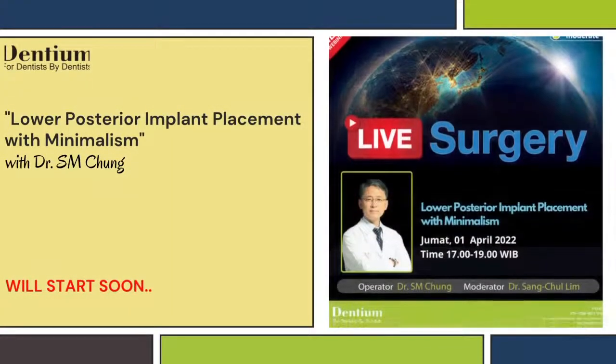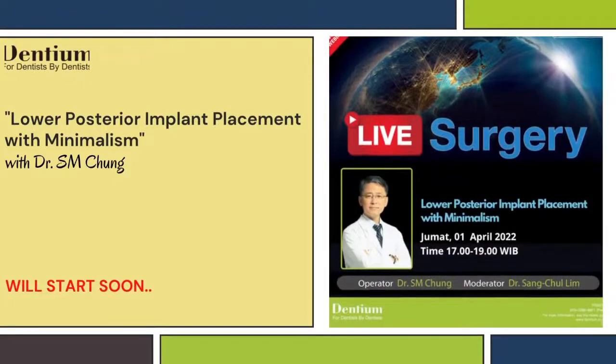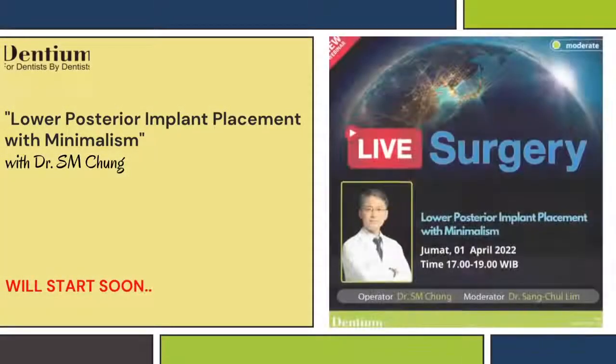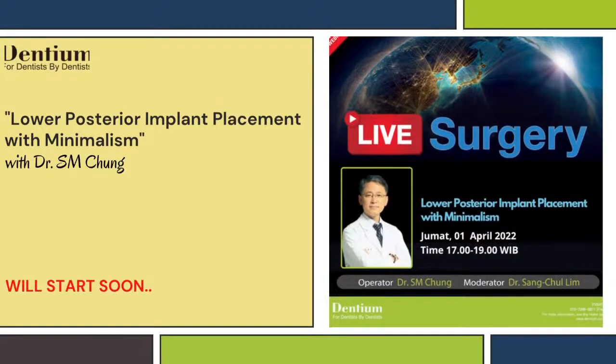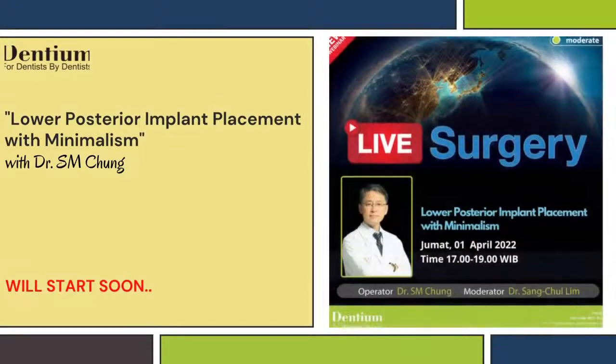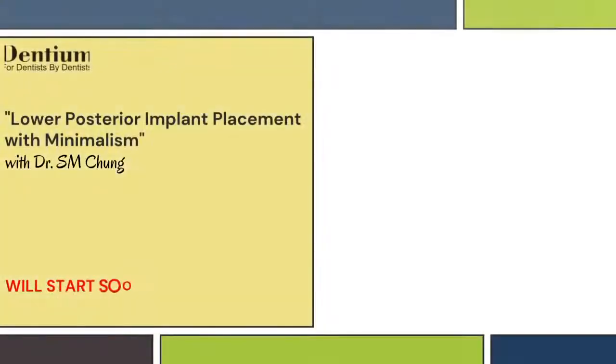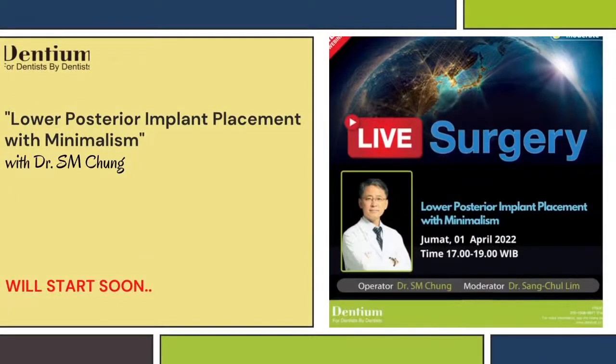This is a very important factor for immediate implantation, early loading, or some other different kinds of situations. So we can use these advantages of a unique implant system from the tissue level. So today's surgery plans are here.